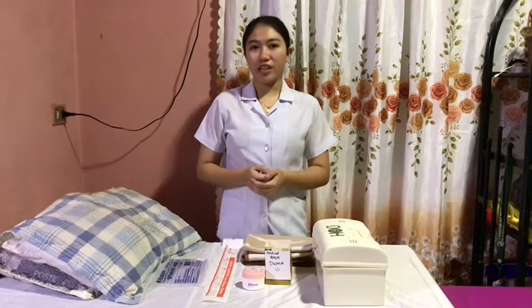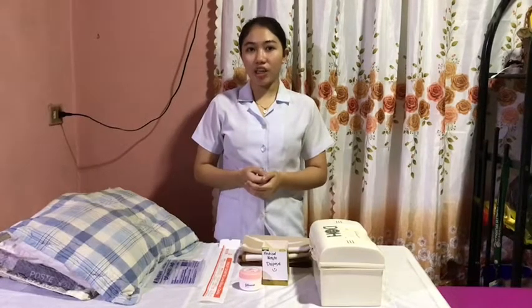So urinary catheterization is the insertion of a flexible tube or catheter through the urethra into the bladder to empty the urine. Catheterization also reduces the risk of infection and kidney damage. So prior to the conduct of the procedure, I have already checked the doctor's order for catheterization. This is to ensure that I have the right patient and the right procedure to be done.